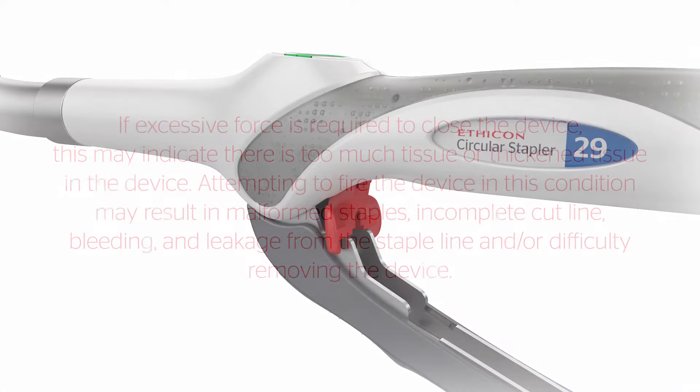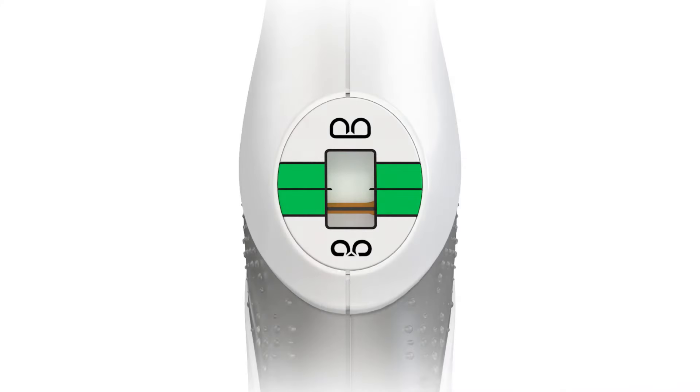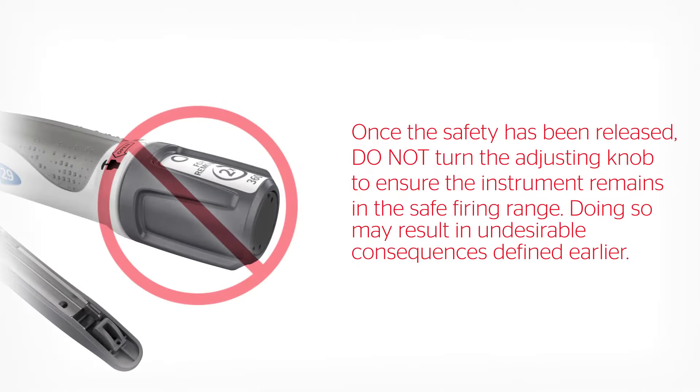To fire the instrument, draw the red safety back toward the adjusting knob until it seats into the body of the instrument. The safety should not be released if the instrument is not in the safe firing range. Once the safety has been released, do not turn the adjusting knob to ensure the instrument remains in the safe firing range, as doing so may result in undesirable consequences.